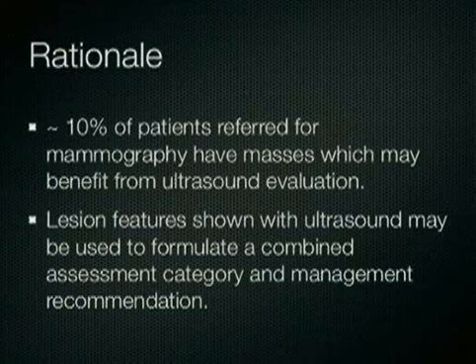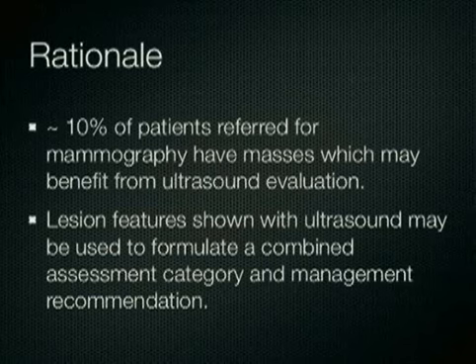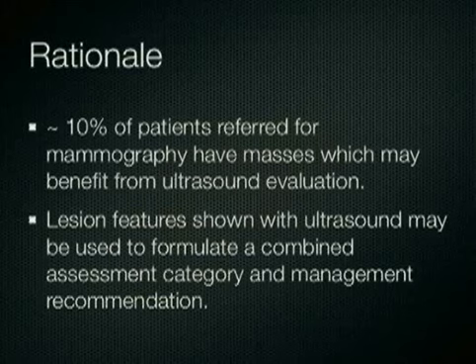The rationale for the development of the lexicon is based on the fact that up to 10% of patients referred for mammography have masses which may be found to benefit from ultrasound evaluation. Lesion features shown with ultrasound may be used, therefore, to formulate a combined assessment category and management recommendation. The BIRADS lexicon forms a basis from which these descriptors and assessment categories may be derived.